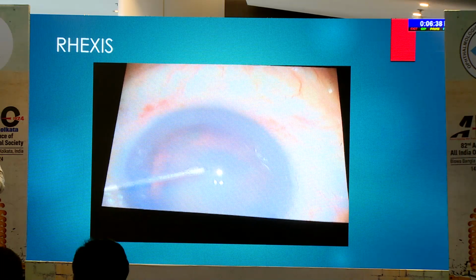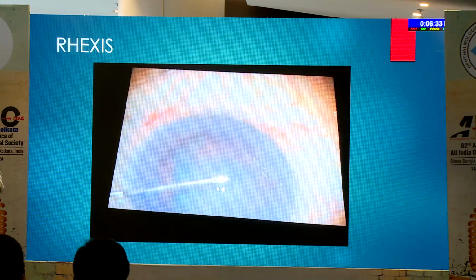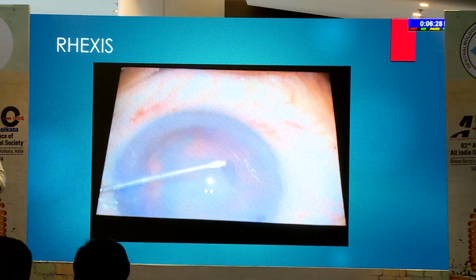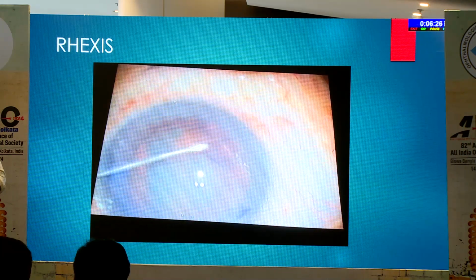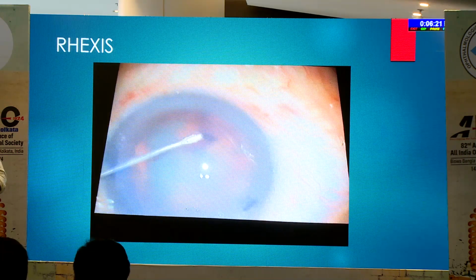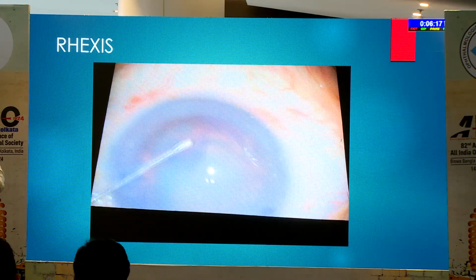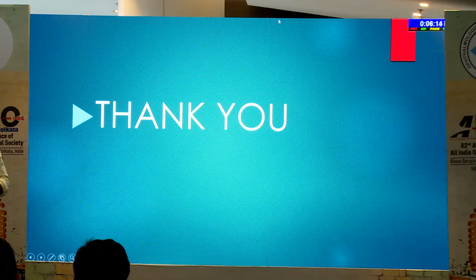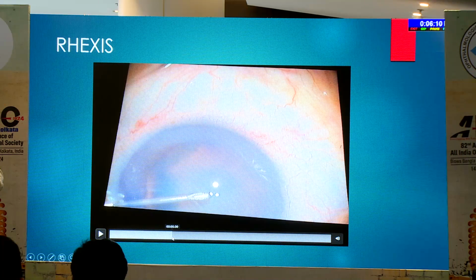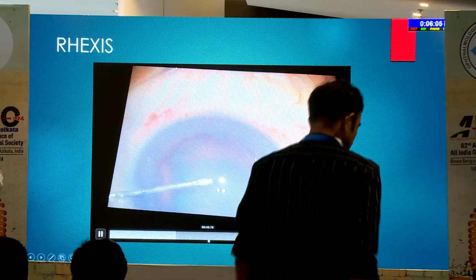One is you can either raise a linear incision or you can raise a flap. Either way, it doesn't matter. Sometimes this is the flap being raised, and you move around. You have the marking of the rhexis outward. This is around 5.5 millimeters, and you could keep moving. As you do that, try to keep folding the rhexis margin. You keep moving the rhexis margin and folding it over it, so that that itself will act as a guide.